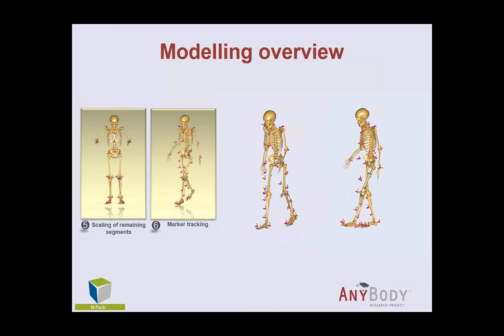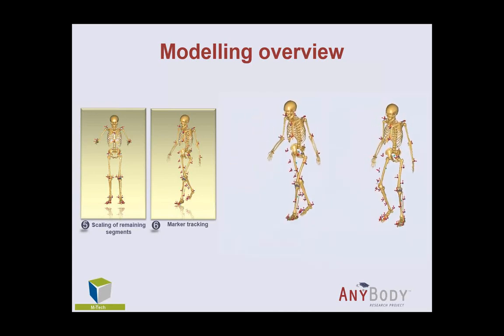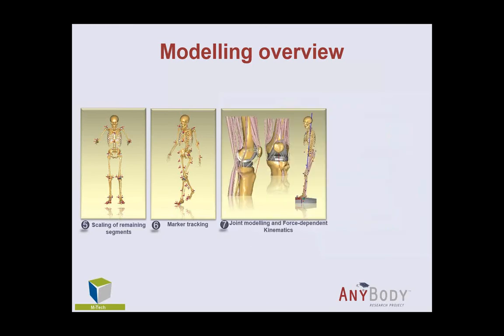And then from this model, we saved all the joint angles, so all the generalized coordinates for this one here, and we're going to use that in a bit. Then we went to do a detailed model of the joint. Actually, you can see it here.